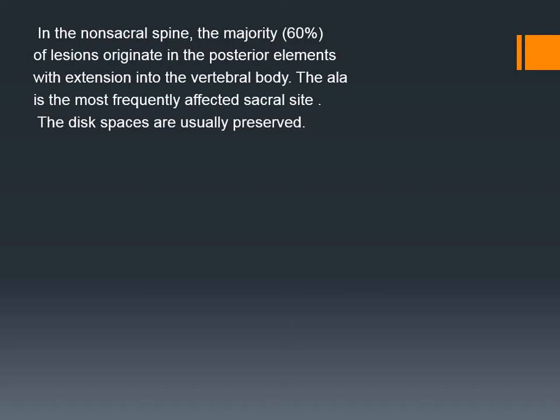In the non-sacral spine, the majority, 60% of the cases, originate in the posterior element with extension to the vertebral body. The ala is the most frequently affected sacral site. The disc spaces are usually preserved.